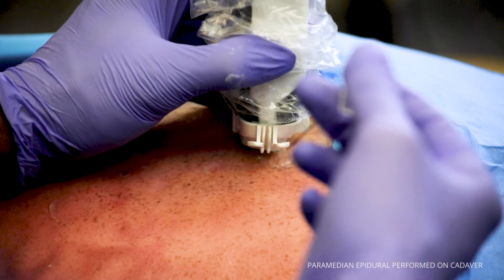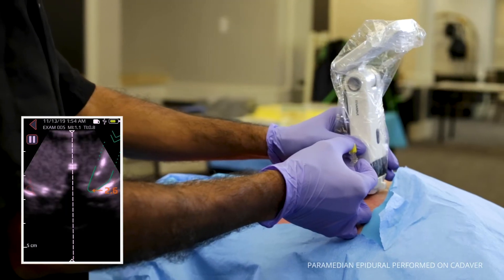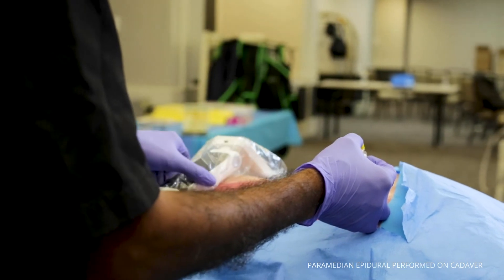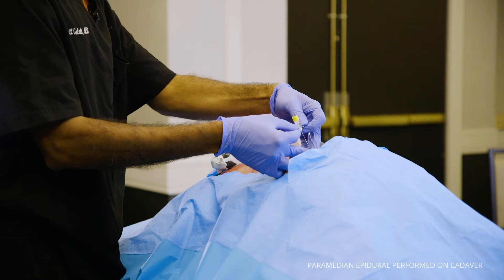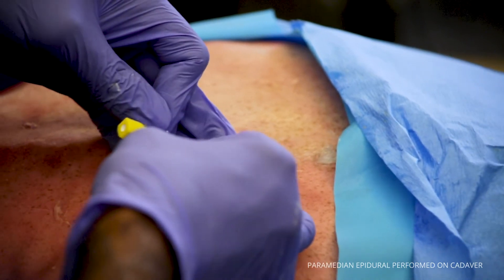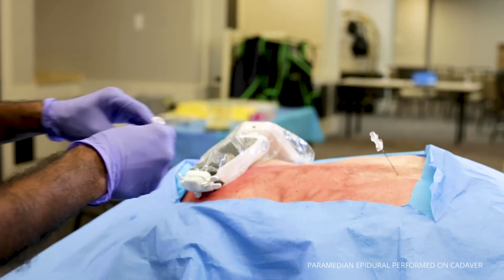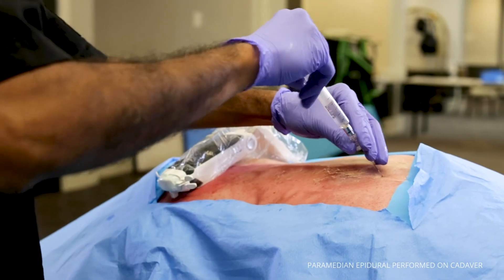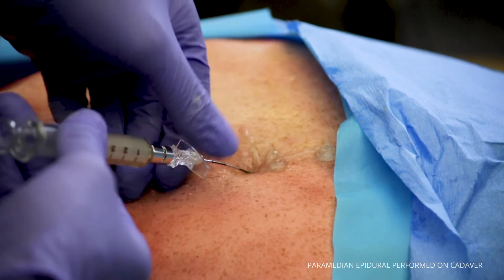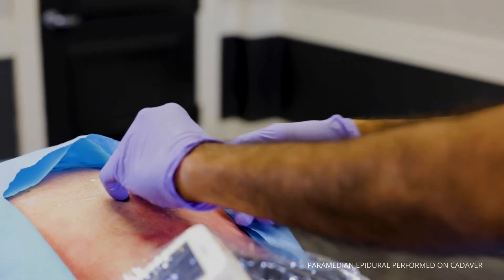At that point, you will insert the thoracic epidural needle after local anesthetic for skin anesthesia. The guide will direct the needle to the lamina, at which time you can take off the Acuro. Once the needle is in the right place, you can use landmark-based techniques to walk your needle off the lamina until you feel the needle has passed through the lamina, at which point you can remove the guide wire and use the loss of resistance to air technique. Once the loss of resistance occurs, you will place the catheter — in this case a guide wire — into the epidural space.